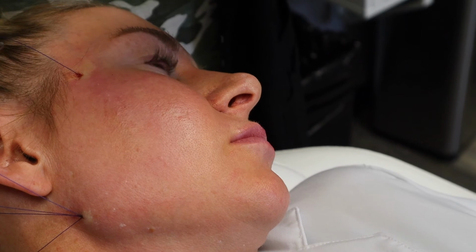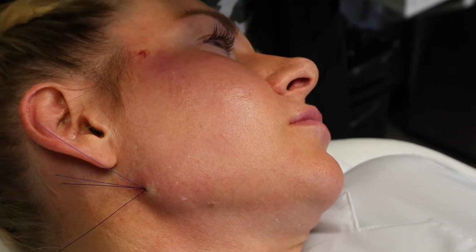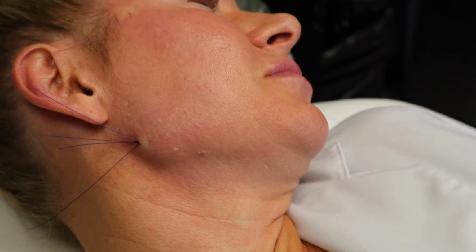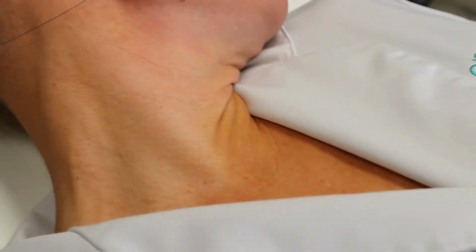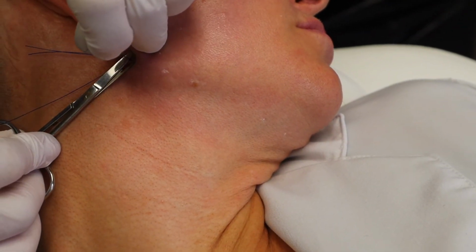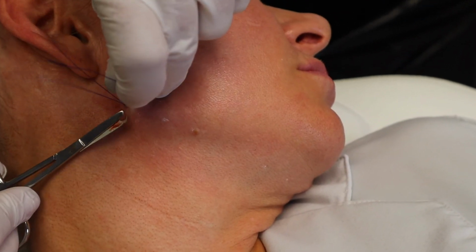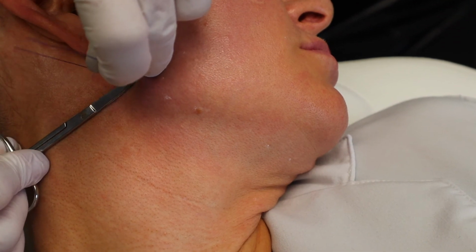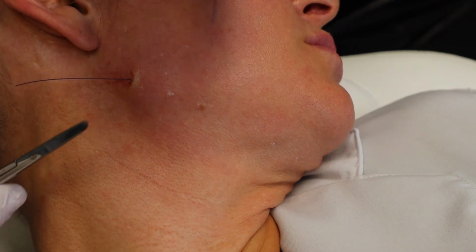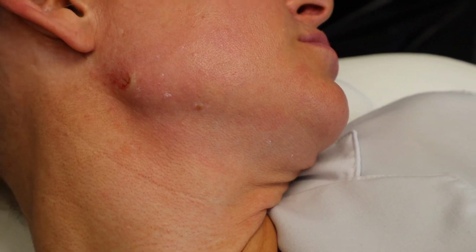The final step in the PDO thread insertion is the clipping of the ends. Prior to this step, we will be sitting the patient up, having them smile, making sure there are no issues at all. The biggest adverse event that could happen with a PDO thread is a thread that's placed too superficially and it can be visible under the skin, and it can be fixed even without any intervention at all. The PDO threads will dissolve and that would eventually go away.